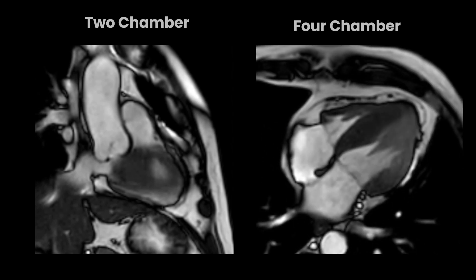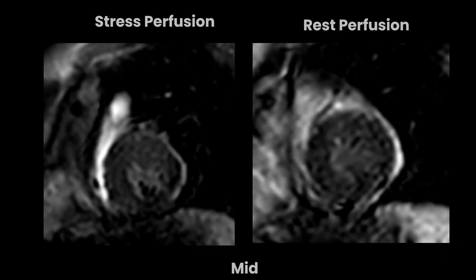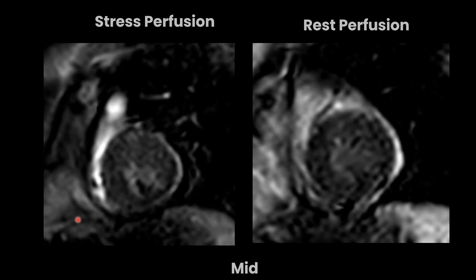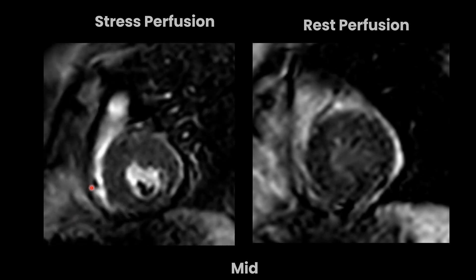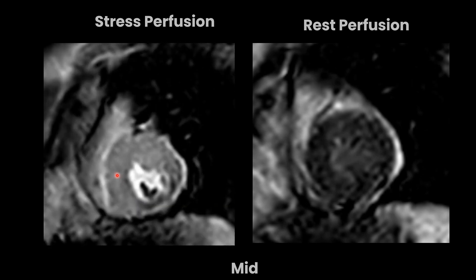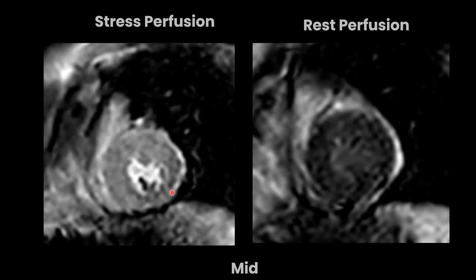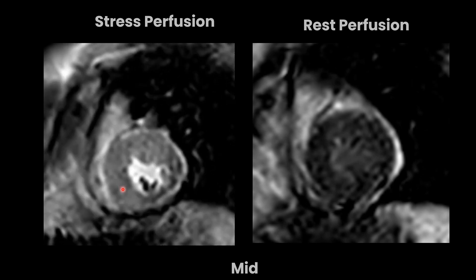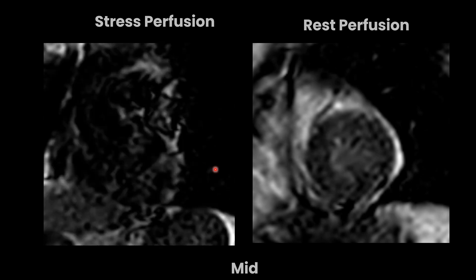Moving to the next set of images — the stress perfusion images. After giving adenosine, we see how the contrast is behaving. The contrast enters the right ventricle, then the left ventricle lumen. There are areas of blackishness — these are perfusion defects seen in stress perfusion images, in the mid segment of the myocardium.